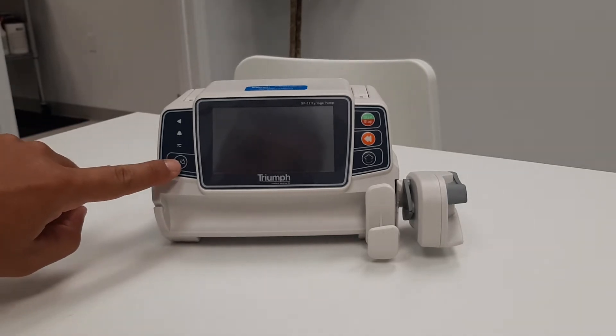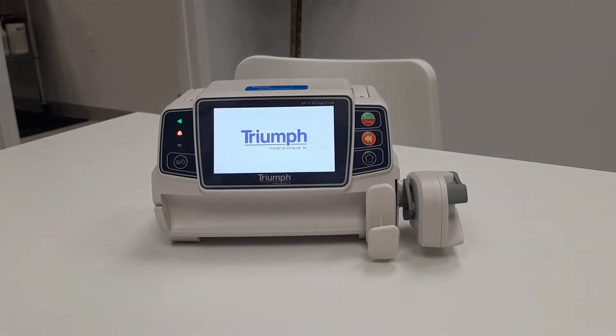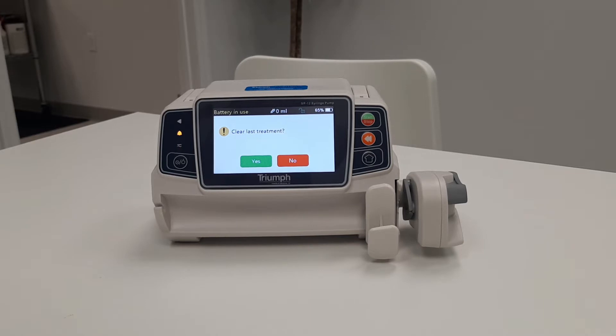Start by pressing the power button for 2 seconds. This will turn the pump on. The pump now prompts the user to clear last treatment. Selecting yes will clear all remaining data from the previous infusion. Selecting no will pick up where last left off from the previous infusion. If no selection is made after 30 seconds, the pump will automatically clear the data.